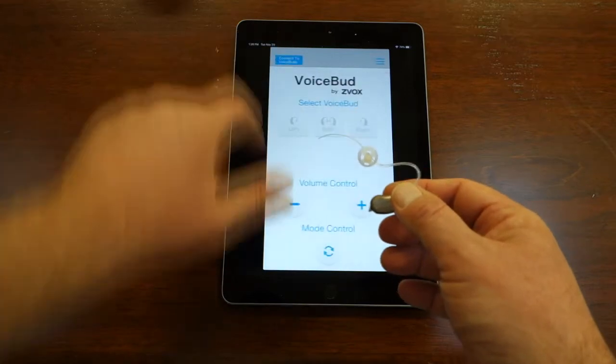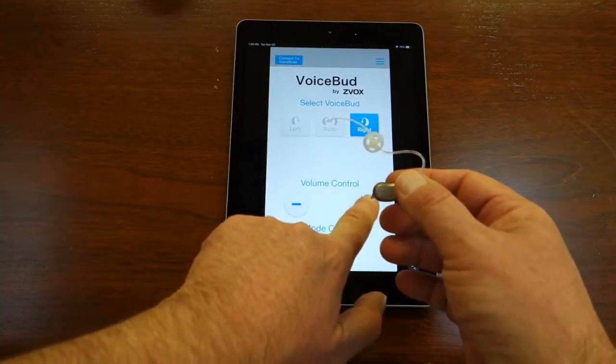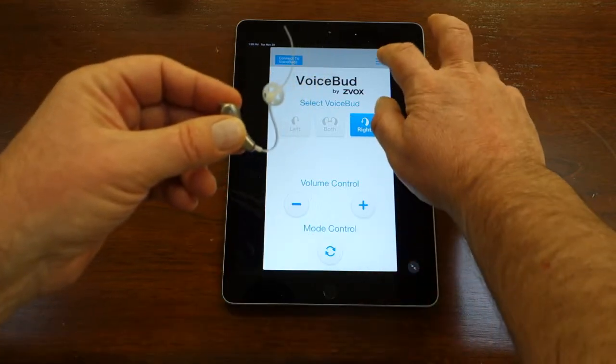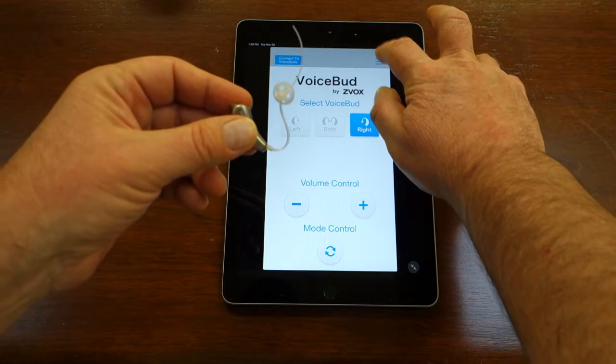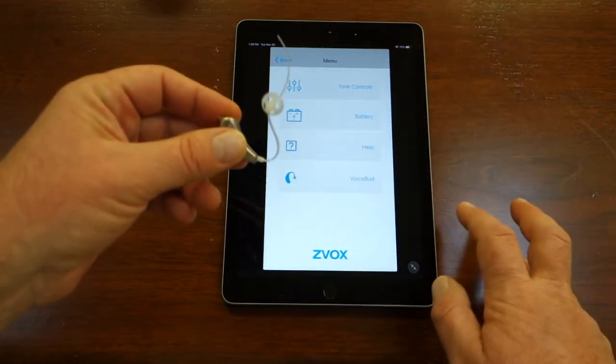Now click the Back button in the upper left to take you to the main screen where you can change volume and mode. At the top right of this menu is a button with horizontal bars. Push this button to access Tone Control and Battery Life.